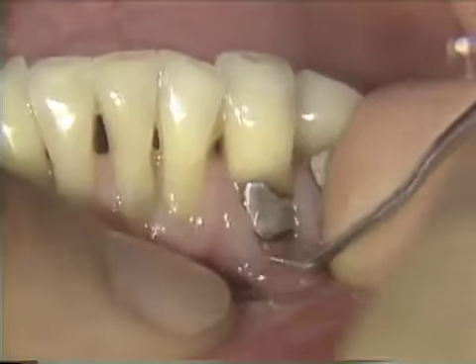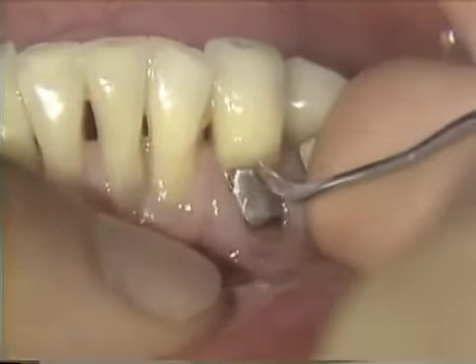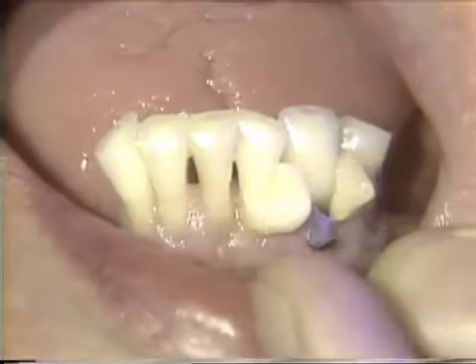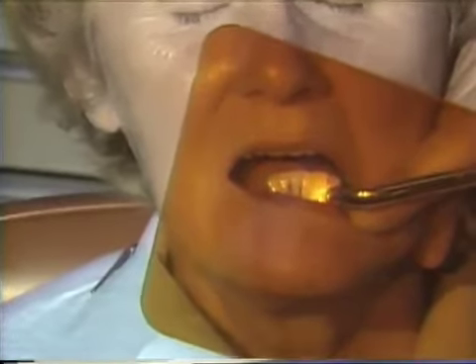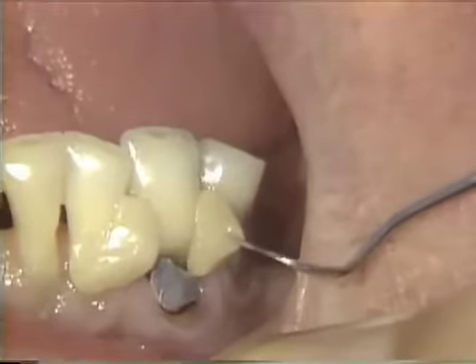Scaling and prophylaxis are performed to remove pellicle, plaque, and any calculus which may hinder a proper margin and interfere with color determination. Preformed and custom-made shade tabs can be useful in determining color selection. For greater accuracy, curing the composite on the tooth prior to isolation is helpful. We can see that both color composites are close to matching the natural tooth color.